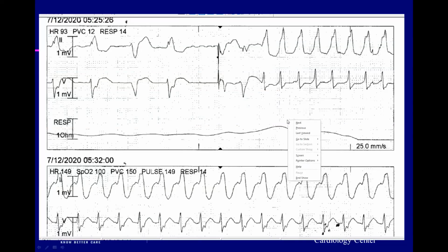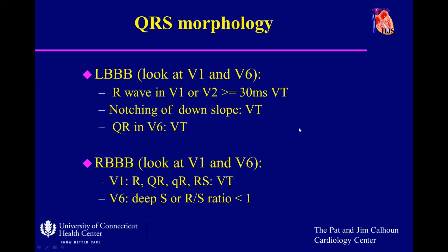Thank you. Let me see quickly. So remember these criteria, that is how you make the diagnosis. The problem often is how to interpret telemetries. As fellows, you often get called for consults, and you see they saw a wide complex tachycardia on telemetry, and you have to make the diagnosis. This is much more difficult, but you get some hints about what the etiology is.